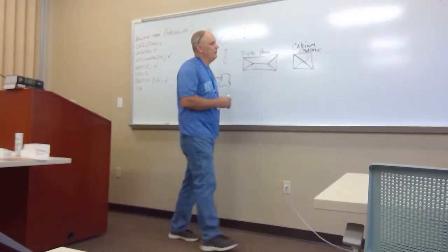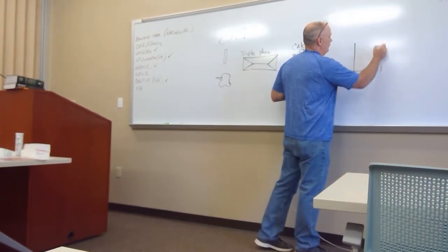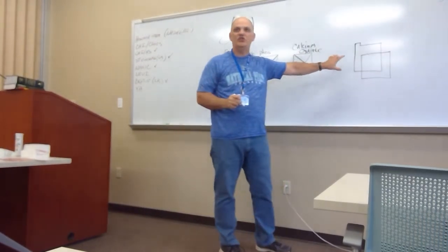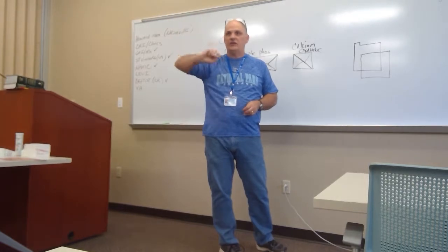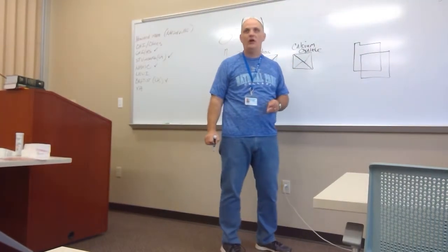All right, a cholesterol crystal. There may be a picture in your book, but you always want to look for the notched edge. It'll look like this, something like that. That's cholesterol. You don't want to see that in urine. They have notched edges. All I can tell you is think of squares stacked up on top of each other. There's usually a notched edge somewhere in it.